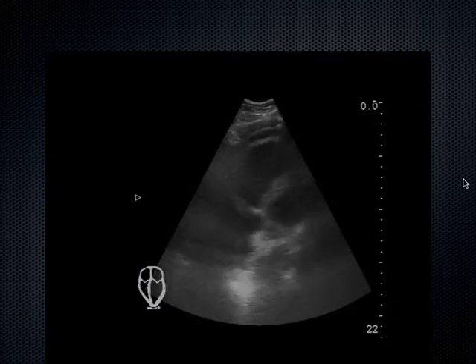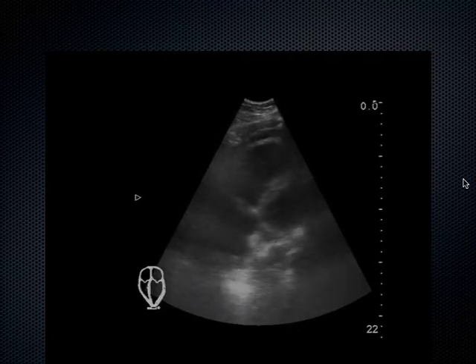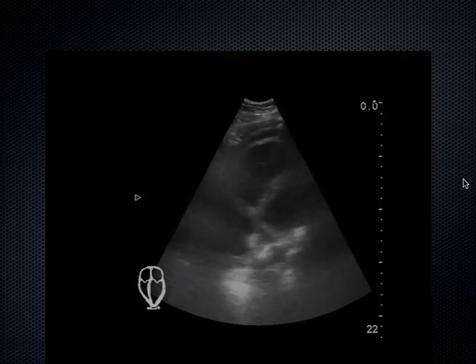This is another patient. This guy was an employee of the hospital who came in to our emergency department coding. Everybody recognized him. One of the things that helped give it away was the fact that he had an external fixation device on his lower extremity. He had just gone home from having orthopedic surgery a couple days earlier and still had the X-Fix on. That was the big tip-off of why somebody would be coding.